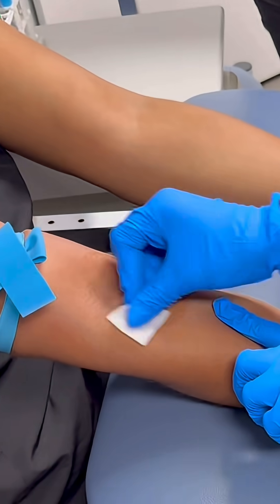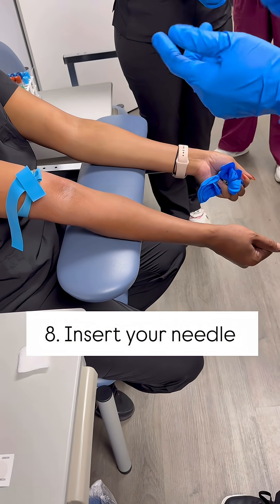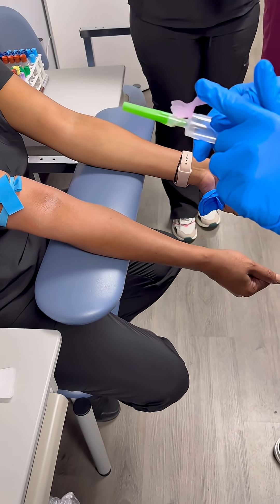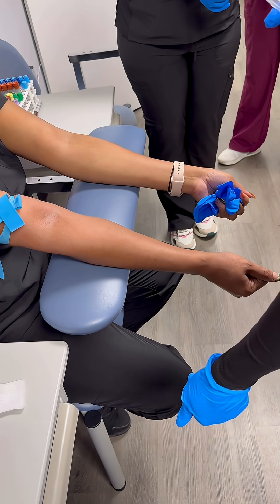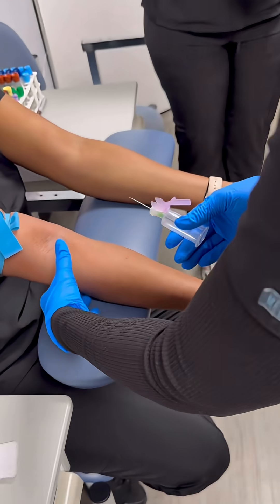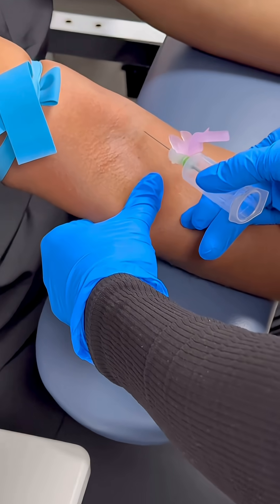This is the vein I'm going to go to, so I'm going to start at the center and spiral out. While that is air drying, I'm getting my needle, pulling my safety back, popping my needle cap off, and putting it in the trash. Kind of just clean up as you go.